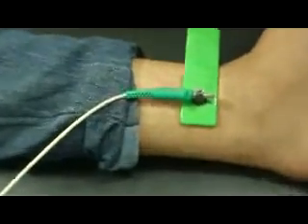The first two, first two: fourth intercostal space. The first two, one, two. The first two, fourth intercostal space. And the last three: last three, fifth intercostal space. You understand what I'm saying? Yeah, please. First two, that is V1, V2, fourth space. Last three, that is 6, 5 and 4, in the fifth space.